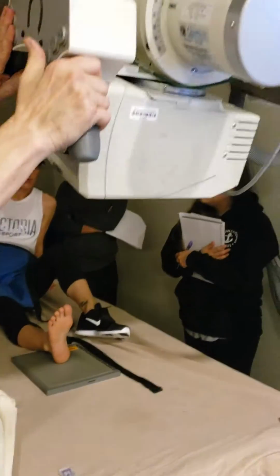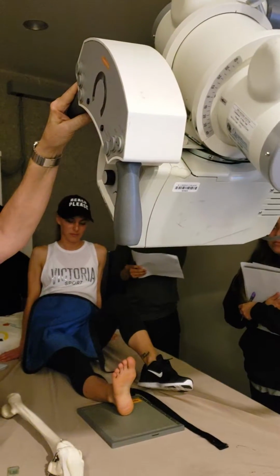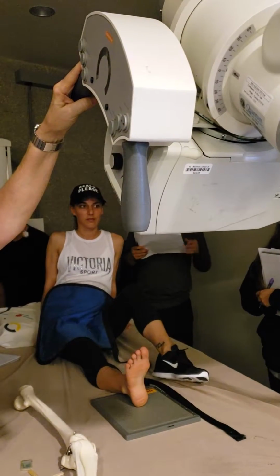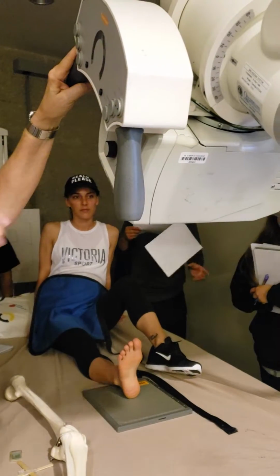Okay, so first thing I'm going to do, we have one. Each room should always have their own meter stick. There's one long one, the 72-inch one, and two short ones. So usually I like to keep them up there on the windowsill. That way we always can visually see they're in each room.